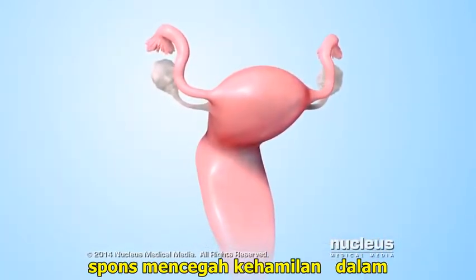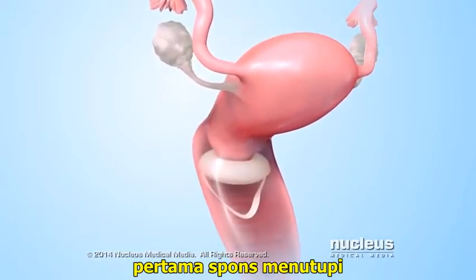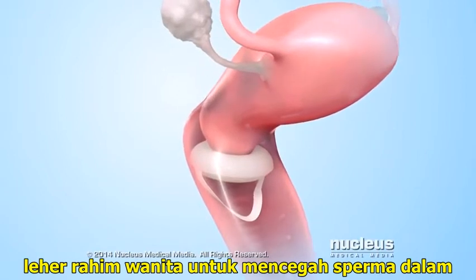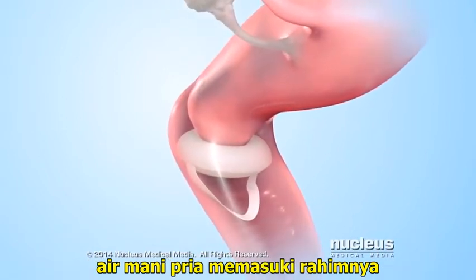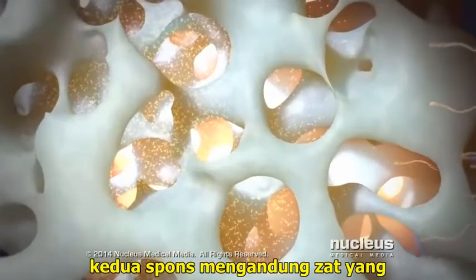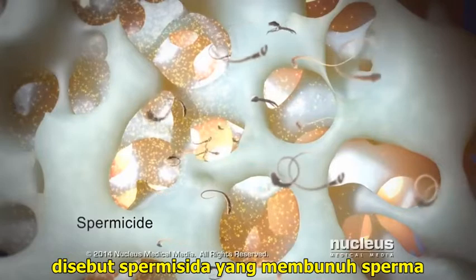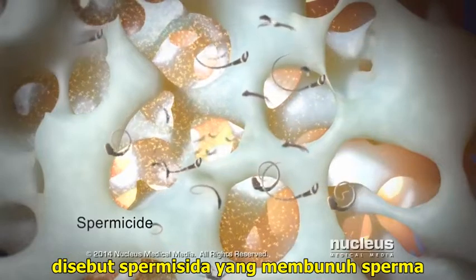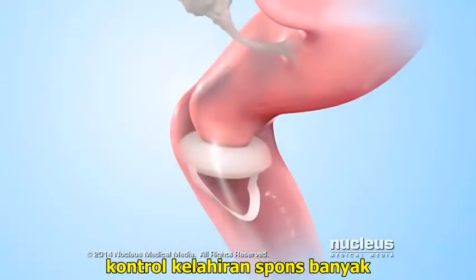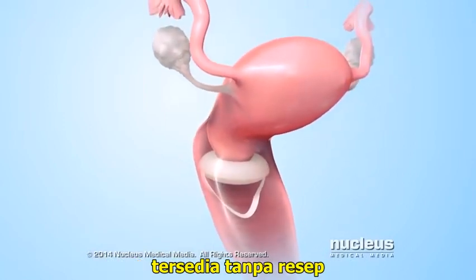The sponge prevents pregnancy in two ways. First, the sponge covers the woman's cervix to prevent sperm in the man's semen from entering her uterus. Second, the sponge contains a substance called spermicide that kills sperm. Birth control sponges are widely available without a prescription.